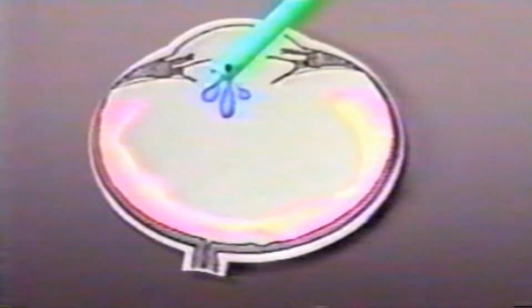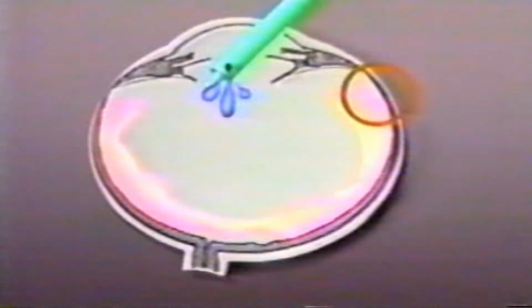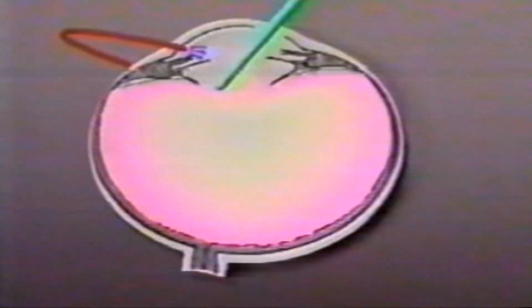In this animation, you can see the vitreous acts like a slinky. When there is a posterior capsule rupture, when there is a coaxial irrigation aspiration, which means that irrigation and aspiration are the same port, there can be an extension or enlargement of the posterior capsule rupture and more hydration of the vitreous, and more vitreous will start coming into the anterior chamber.